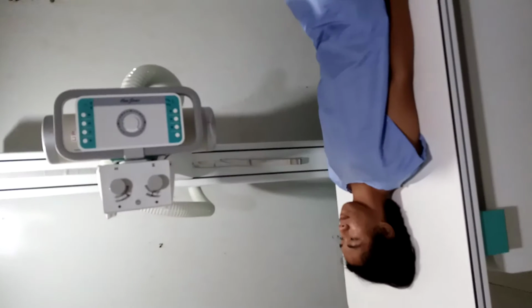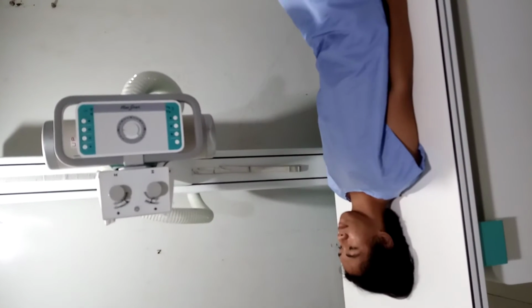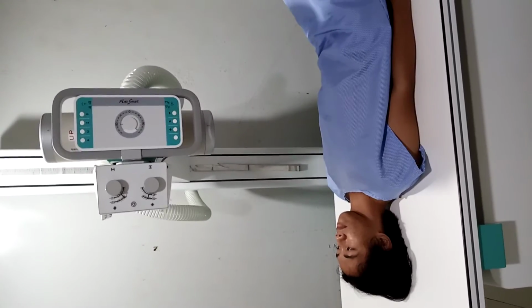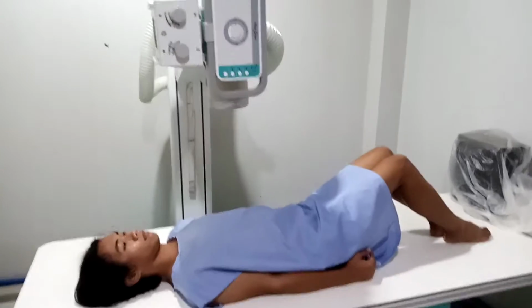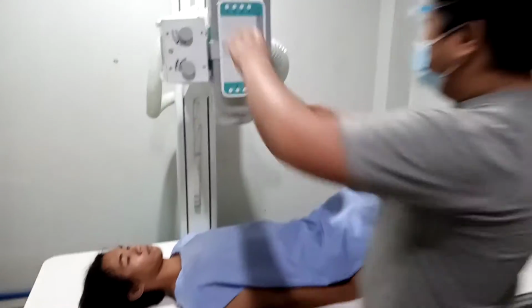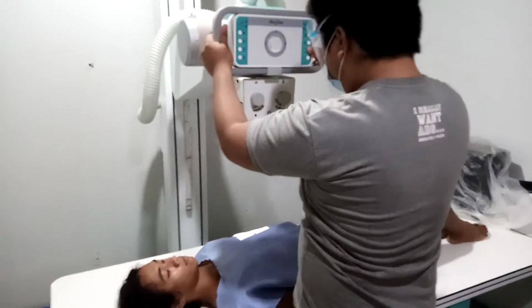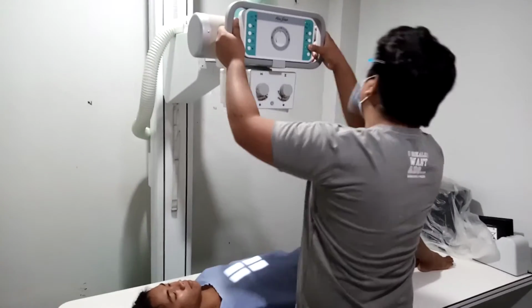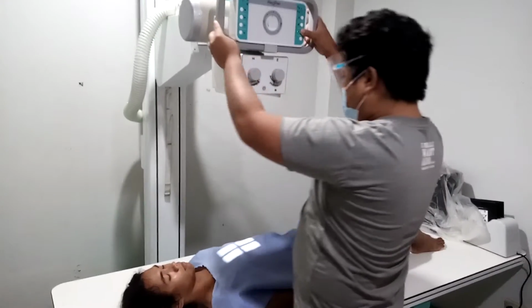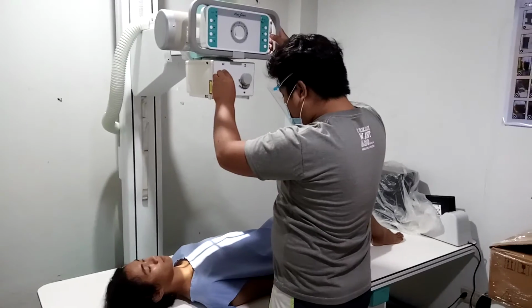Then the central ray must be perpendicular to the IR, and the central ray should be approximately midway between the jugular notch and the xiphoid process. So, manipulate this one. This SID is 70 to 72 inches. Then collimate.